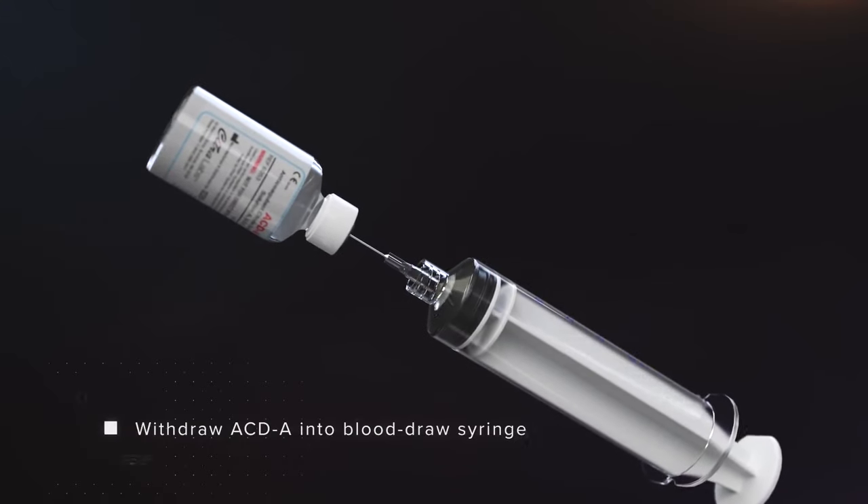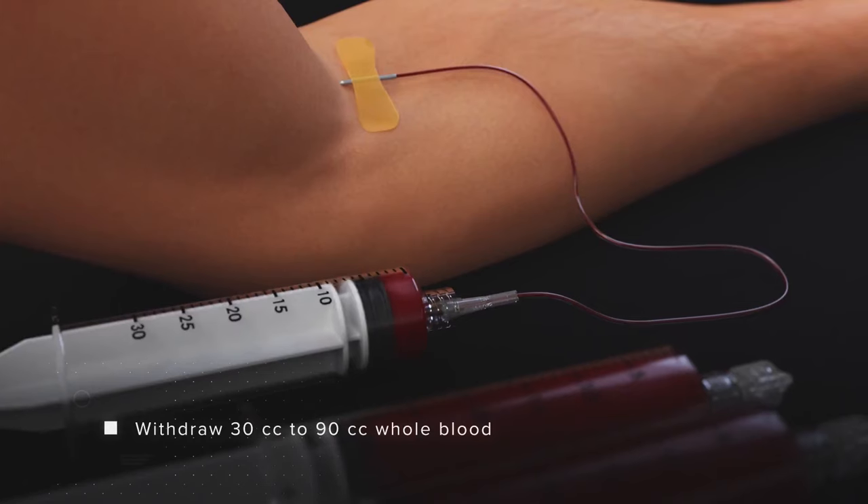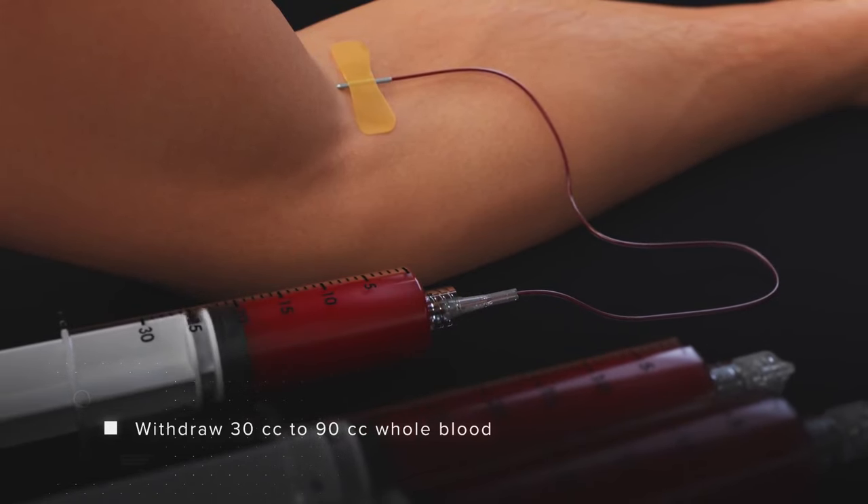In this demonstration, we will be using 60 mLs of blood with anticoagulant. The volume of anticoagulant is dependent on the volume of blood drawn in a 1-to-7 ratio.